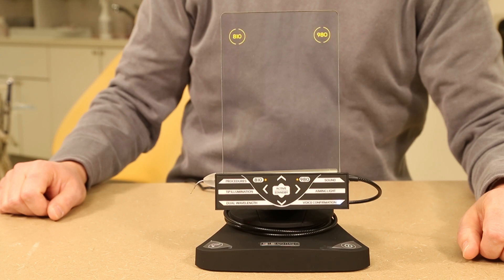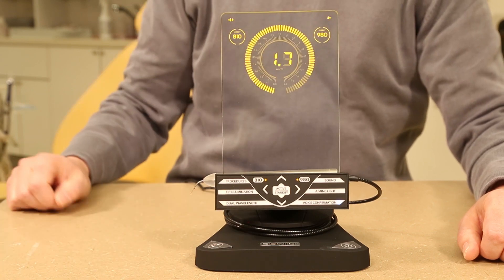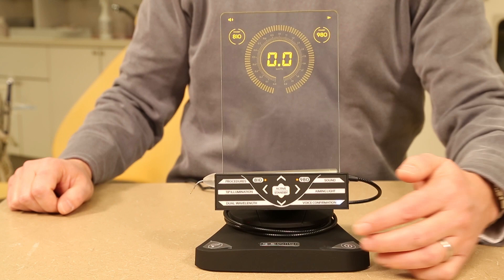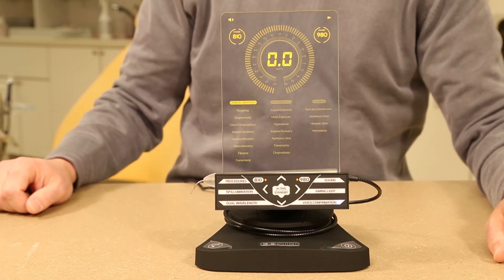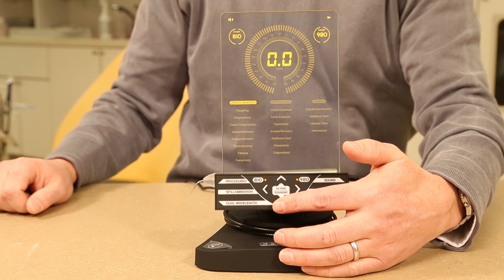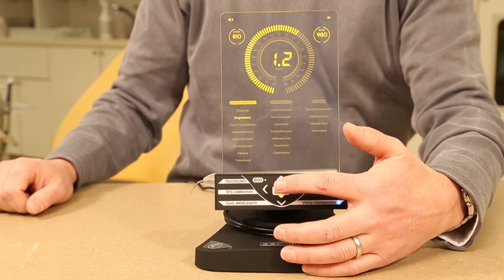Next you will select the desired wavelength: 810, 980, or dual. You can then adjust your power setting manually or select your procedure from the list of preset procedures. Once toggled to your power setting or preset procedure, hit the active/standby button in the middle of the touch keypad.